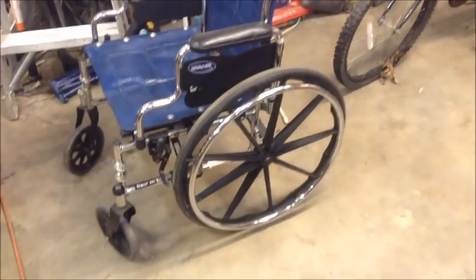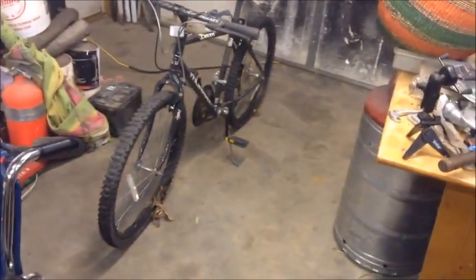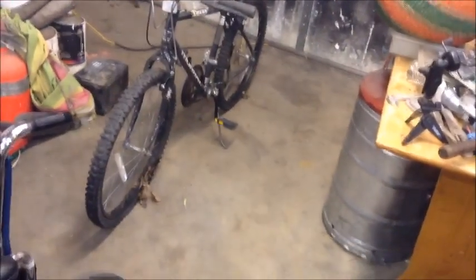Right, this is the wheelchair we're going to use, and this is the bicycle, and this is just a bicycle we got out of the scrap, $20 rummage sale. Steel frame means it's weldable. Now, down here on the back of the wheelchair, we'll see we have these two arms that stick out, and most wheelchairs do have those. Those are sticking out about 4 inches.